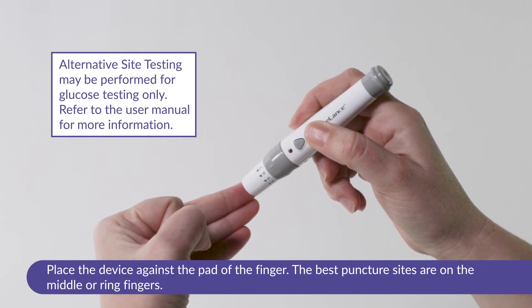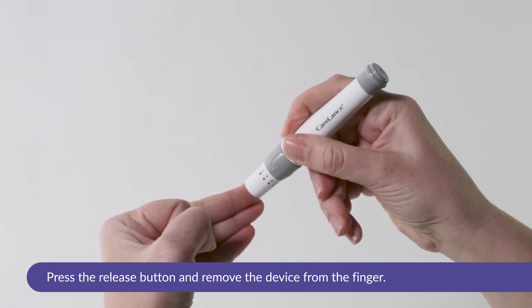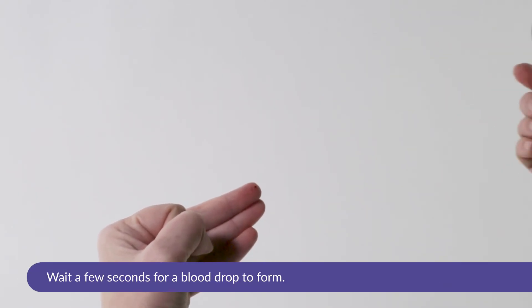Alternative site testing may be performed for glucose testing only. Refer to the user manual for more information. Press the release button and remove the device from the finger. Wait a few seconds for a blood drop to form.